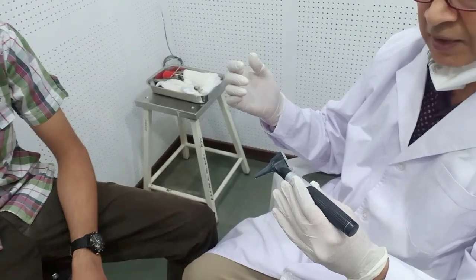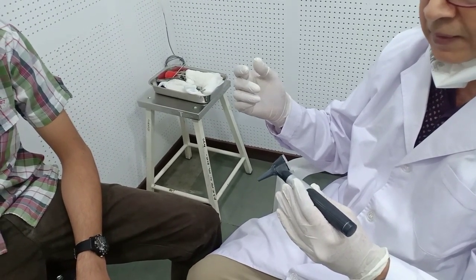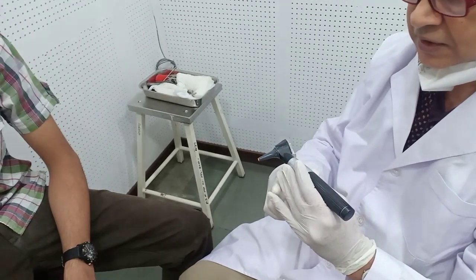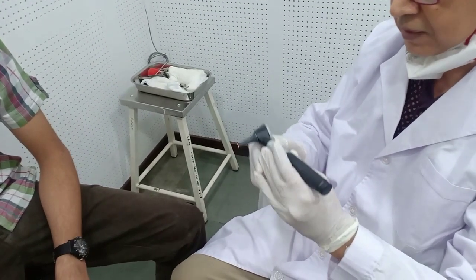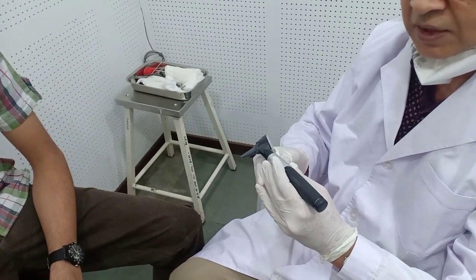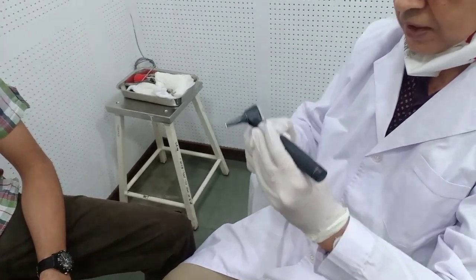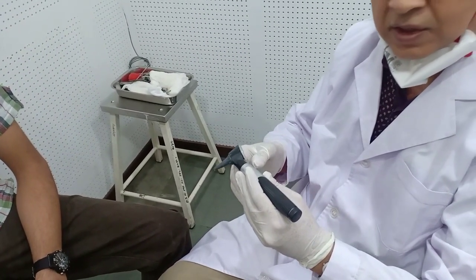After retracting the pinna, we introduce the tip of the ear speculum. Because our little finger is touching the patient's face, if the patient moves, the otoscope also moves along with that movement, so that no injury will occur. Otherwise, if it suddenly moves and you do not have control, if they are not moving in unison, that can lead to injury to the external auditory canal.